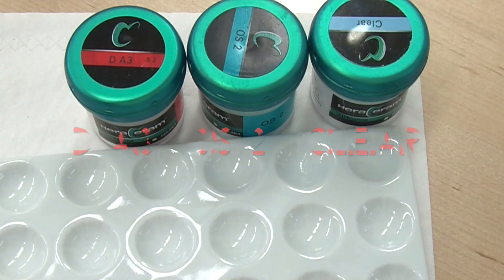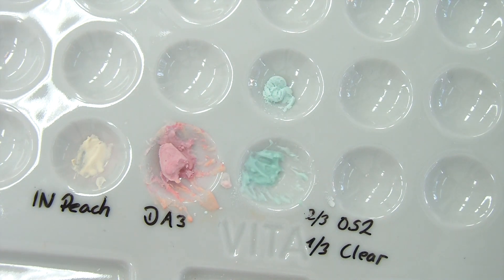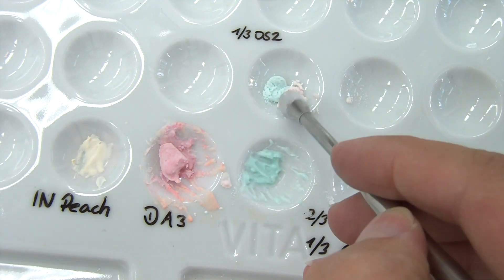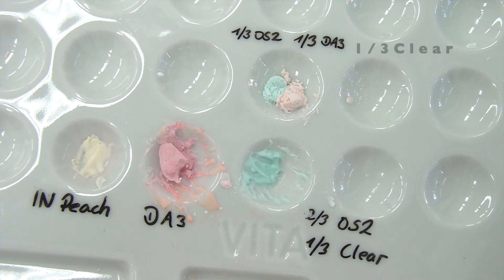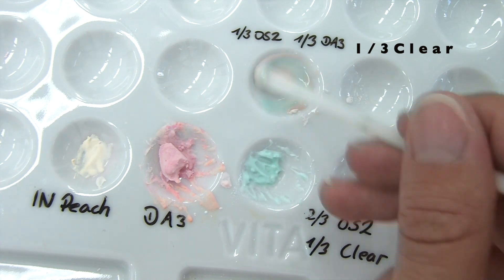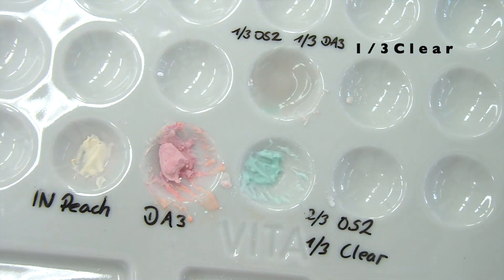We continue with the second burn. We need dentin A3, OS2 and clear. Mix these with their modeling liquid to a creamy consistency. I only use distilled water to mix the dry ceramics from the pre-video.